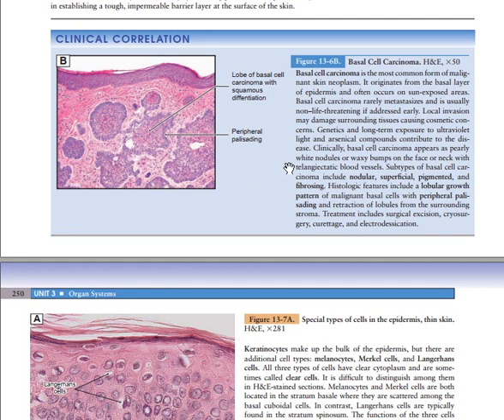Is it clear? So the most common skin cancer, how do you visualize it on the histology section? It originates from the basal layer of the epidermis and not the keratinocytes in the stratum corneum, and also occurs in sun-exposed areas. So you have lobes of basal cell carcinoma with squamous differentiation. You have peripheral palisading, so you can visualize peripheral palisade.